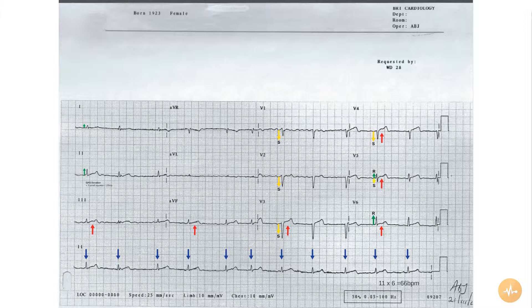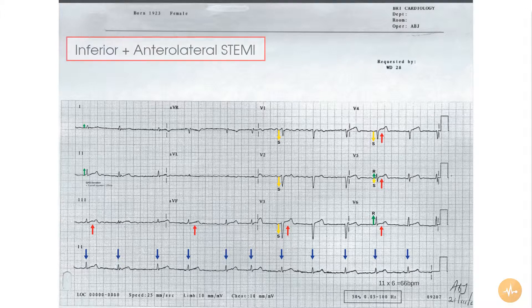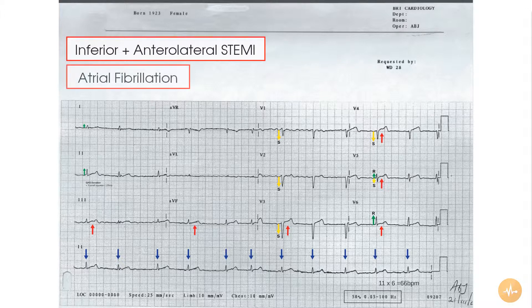In summary, this ECG recorded from a patient who has had an episode of cardiac sounding chest pain reveals ST segment elevation in the inferior and anterolateral leads and abnormal R wave progression in atrial fibrillation.